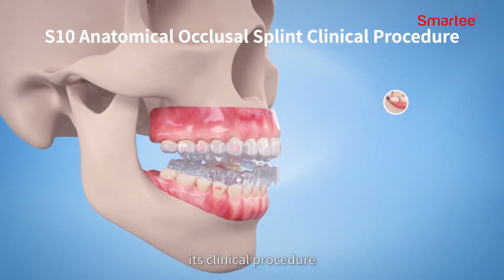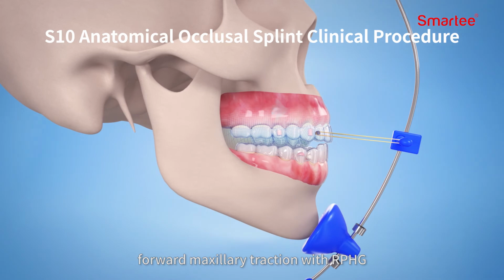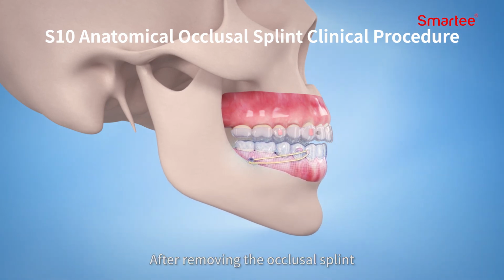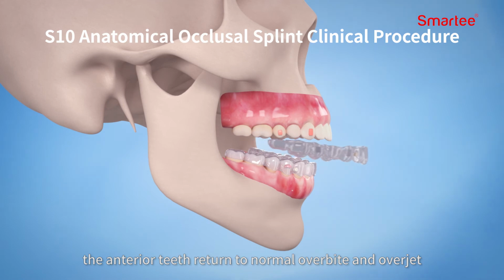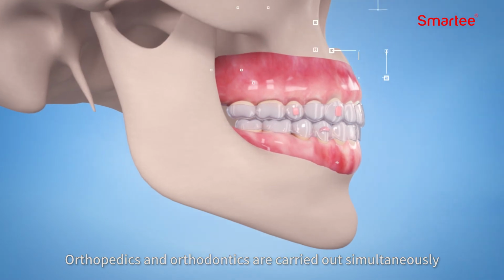Its clinical procedure includes forcing the mandible to retrude to the anterior edge-to-edge position, forward maxillary traction with RPHG, distalizing the lower molars and moving backward whole lower dentition. After removing the occlusal splint, the anterior teeth return to normal overbite and overjet, and posterior cusp-fossa contact can be achieved. Orthopedics and orthodontics are carried out simultaneously.